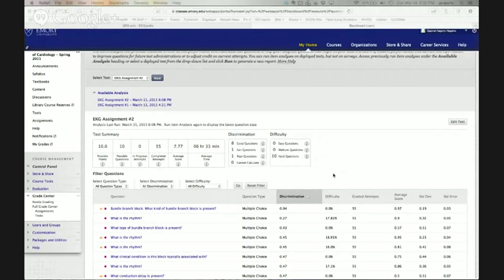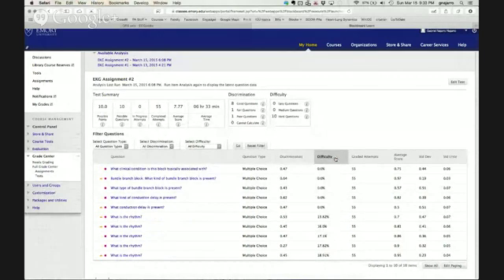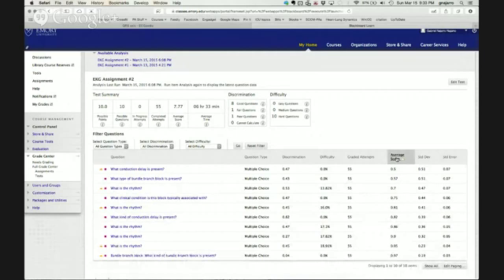Okay. So this is the item analysis for the 10 questions. It was 5 questions on bundle branch blocks and 5 questions on arrhythmias. Funny thing is, I think most of you got the bundle branch ones, but the arrhythmia ones were, I guess, a mix. All right, so average score.